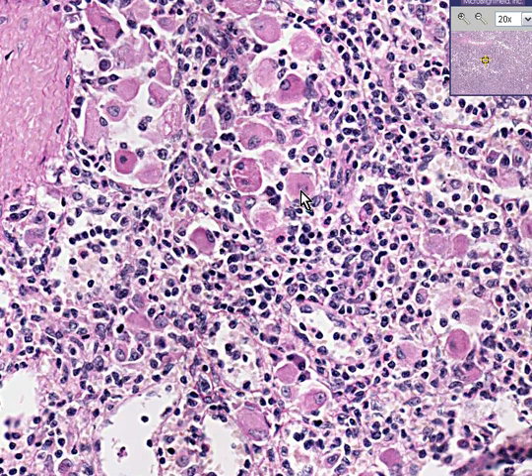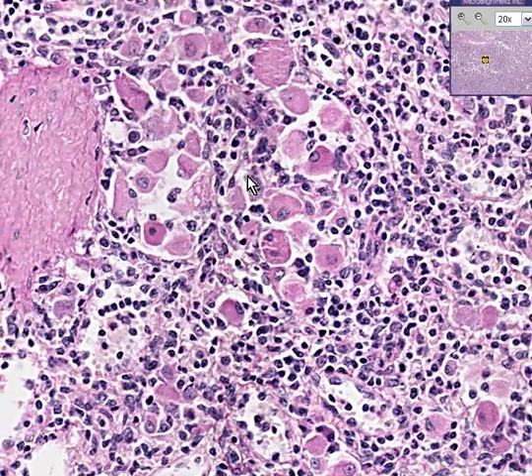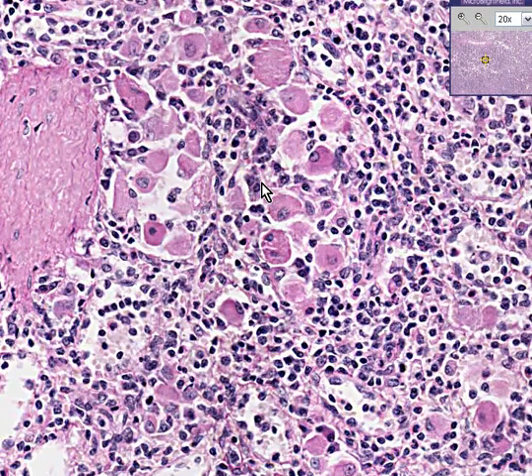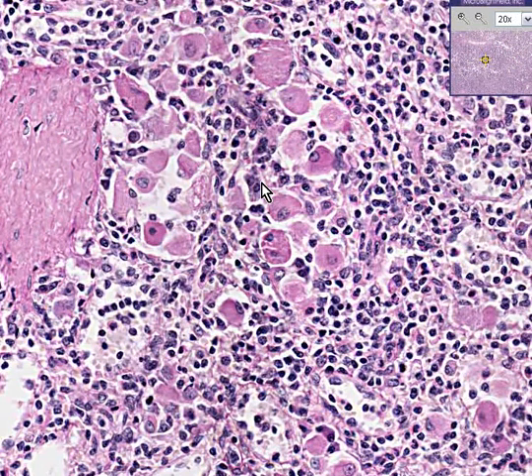the substance glucocerebroside builds up to the point that there's just too much of it, and these foamy histiocytes start to eat it and store it. This is a genetic disease — not too common. Basically every organ in the body can show Gaucher cells: the spleen is most likely, but they're also in the liver, kidney, lungs, and all over the bone marrow.